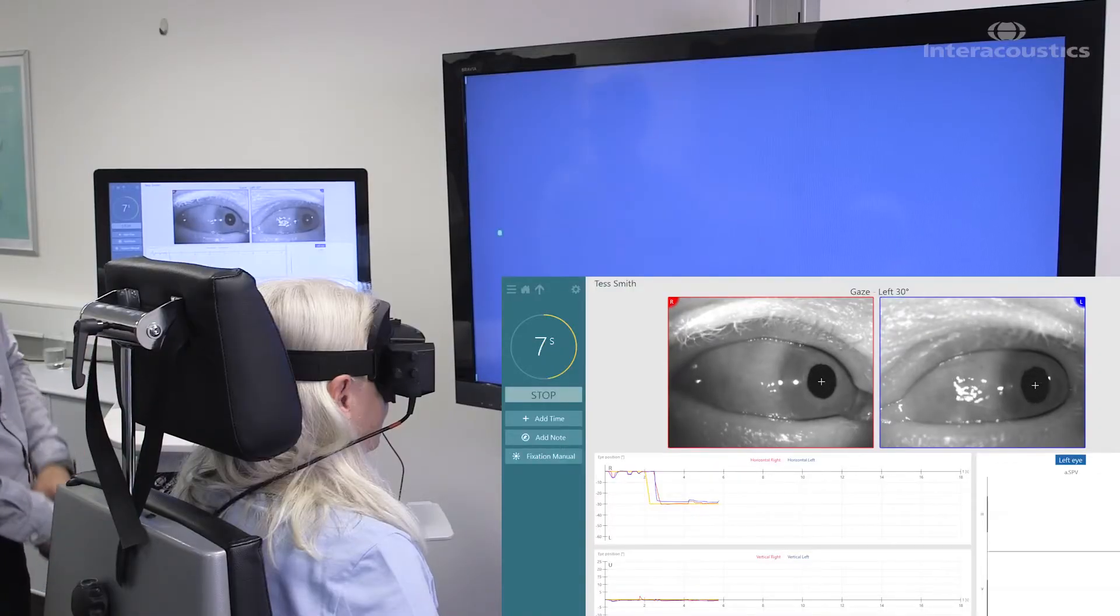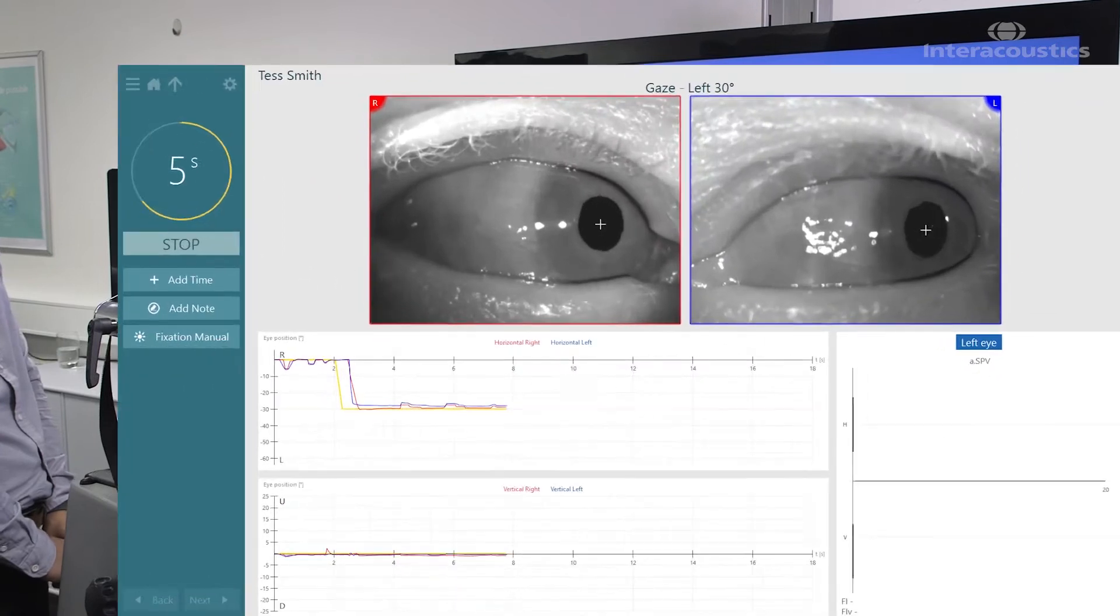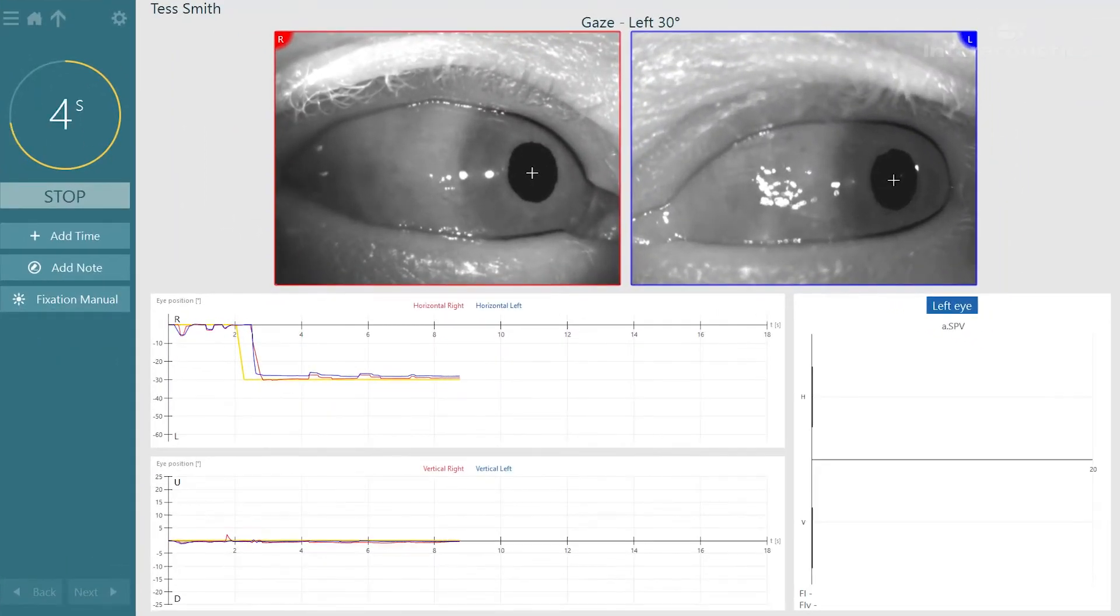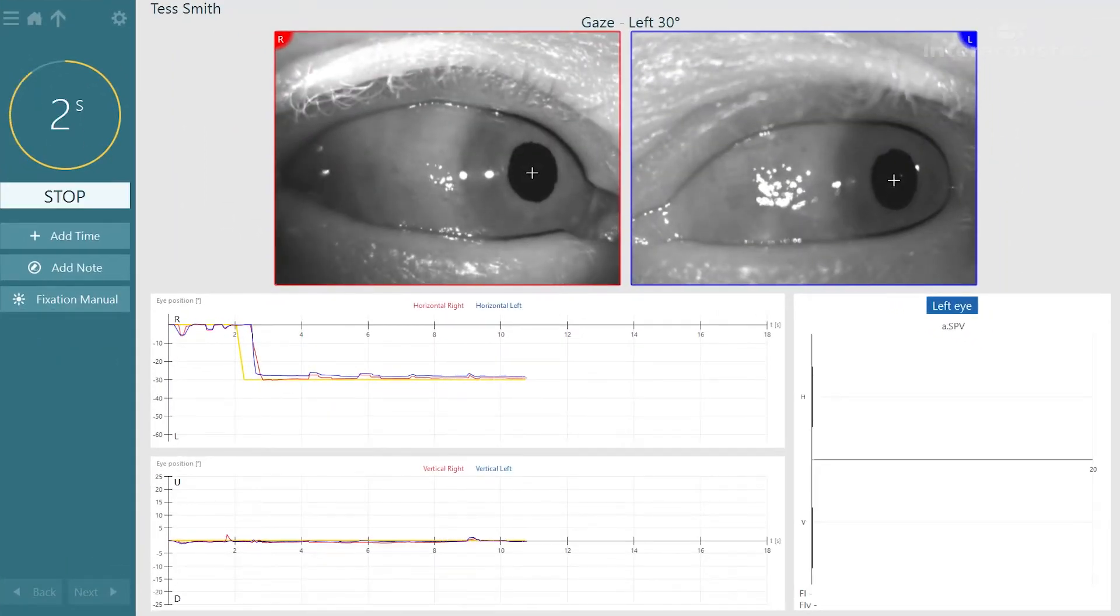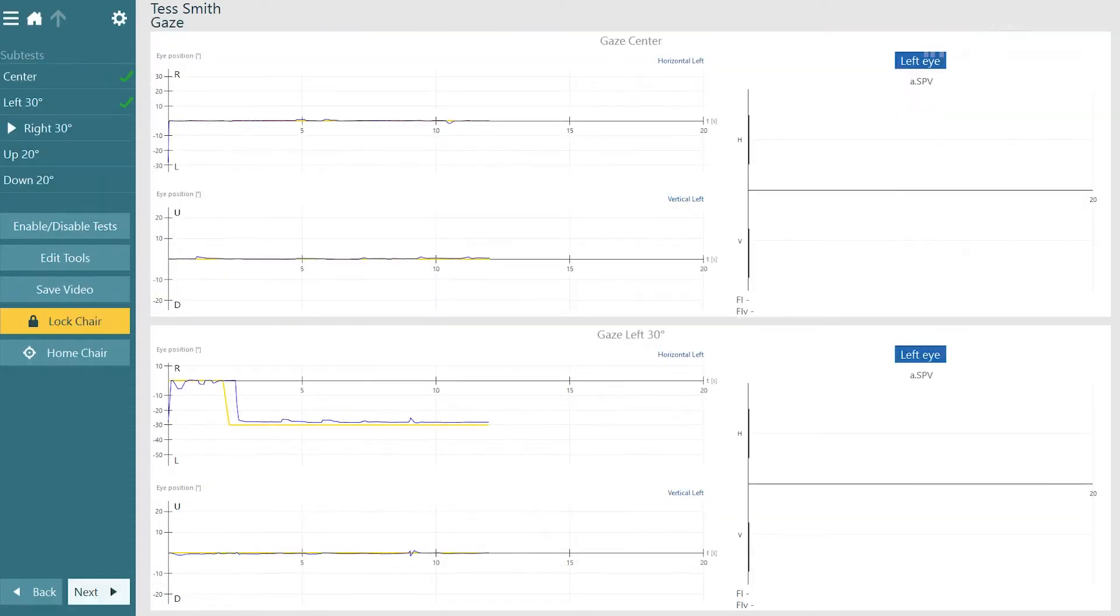On the graph what we can see is a yellow line representing the target moving and the red and the blue lines representing the right eye and the left eye.